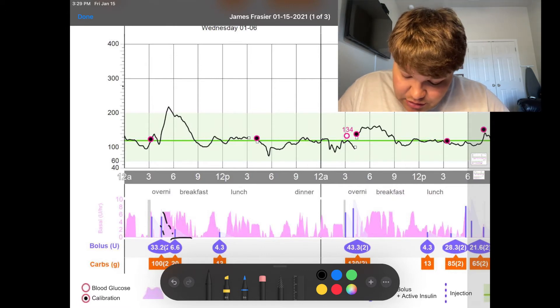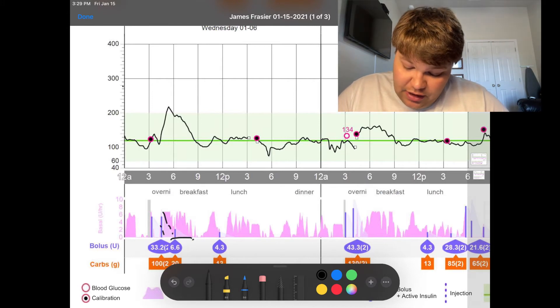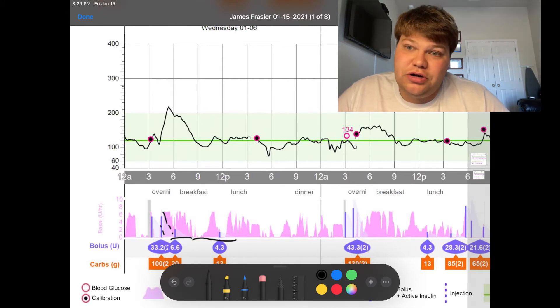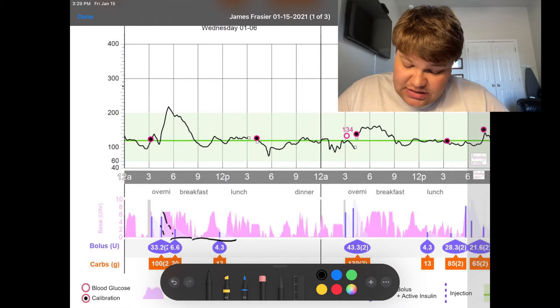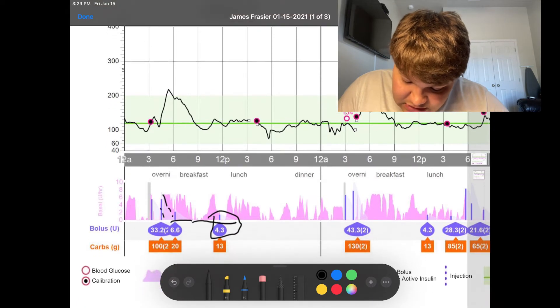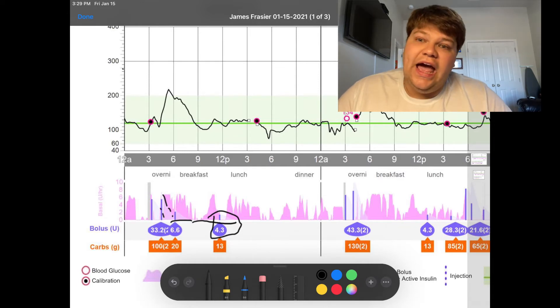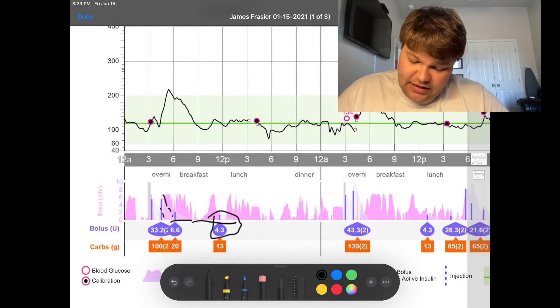You can see this other bolus that's small — 13 grams of carbs. That's my Glucerna that I'm drinking. I typically start drinking my Glucerna about five minutes after, since it is a small bolus. You can see clearly there — I'm going to mark it in blue — the active insulin time. As you see that go down, auto mode ramps back up again to make sure that my blood sugar stays sustained.